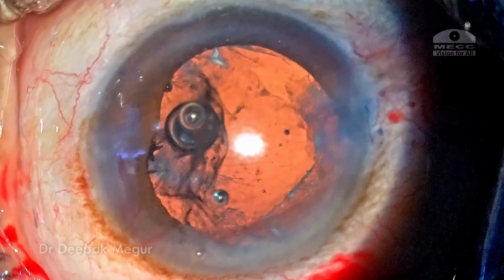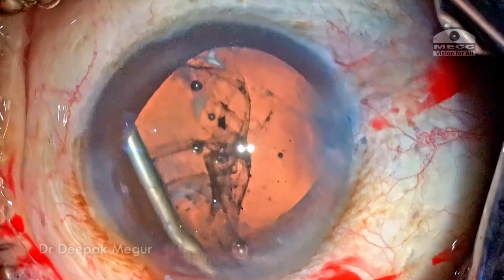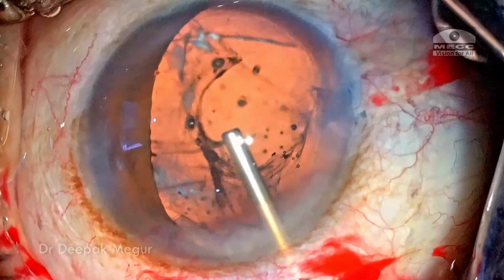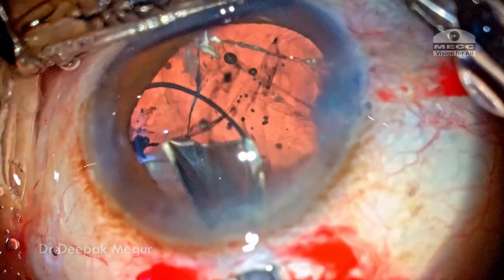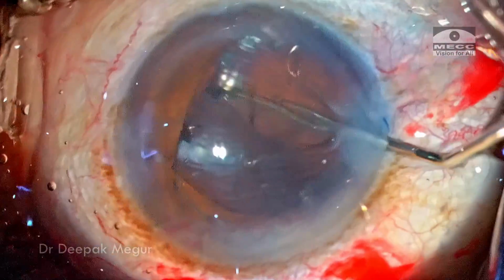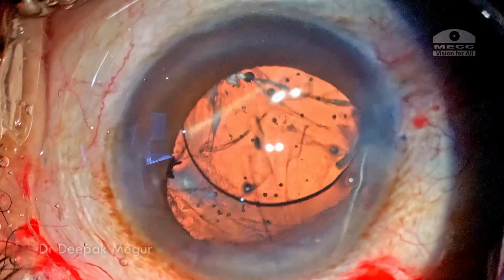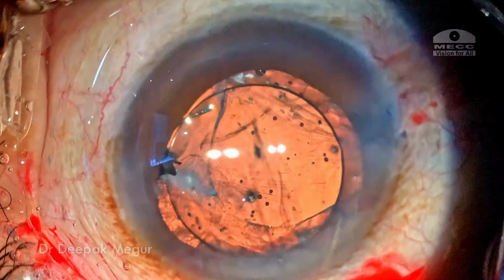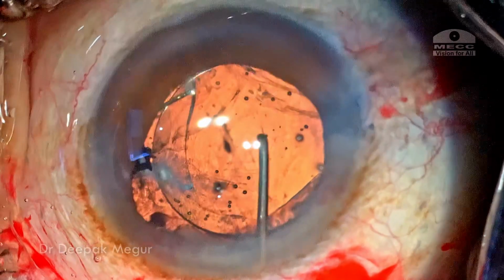I prefer to use the cohesive OVD in such situations because the chamber maintenance is better and we don't have a shallowing of the anterior chamber, and especially in these eyes which have undergone vitrectomy, there is a greater tendency to be hypotonous, and this helps us to create some space. Both the haptics are in now. I'm just trying to dial and ensure that the haptics are away from this area of the capsular bag defect.